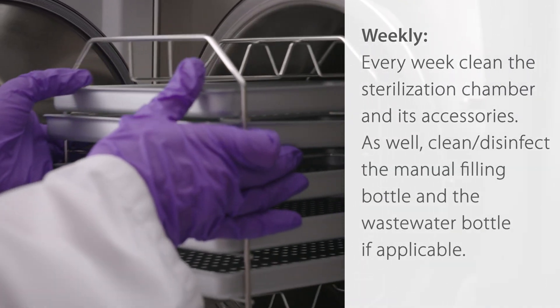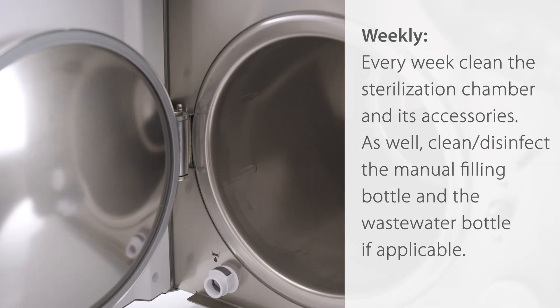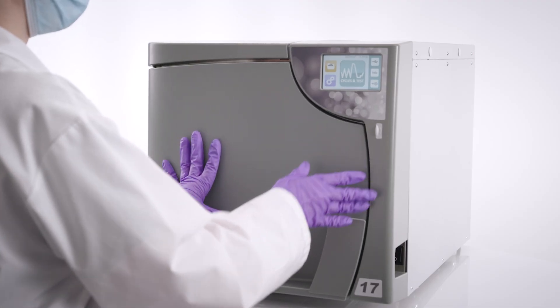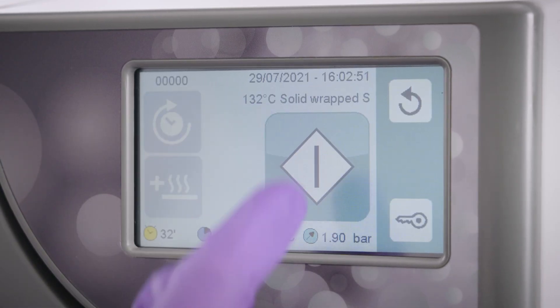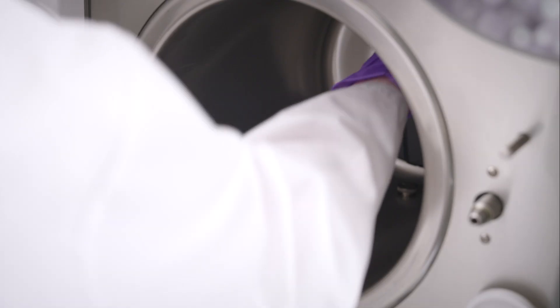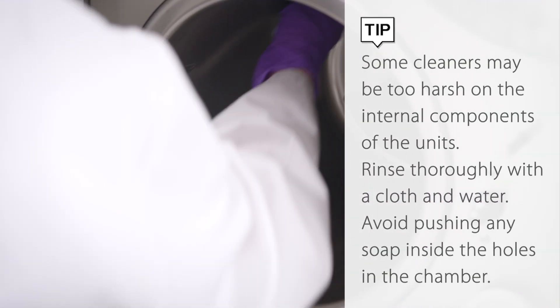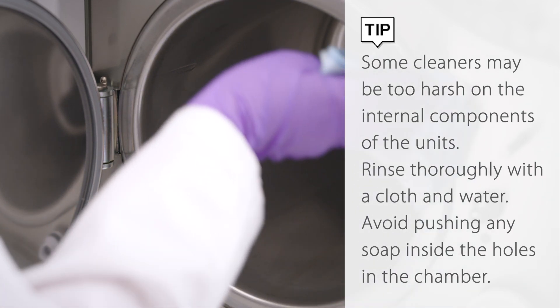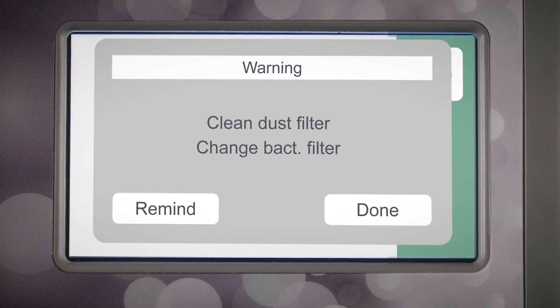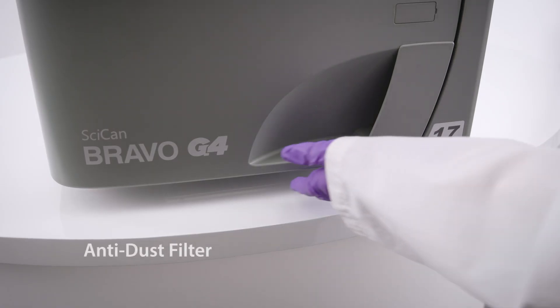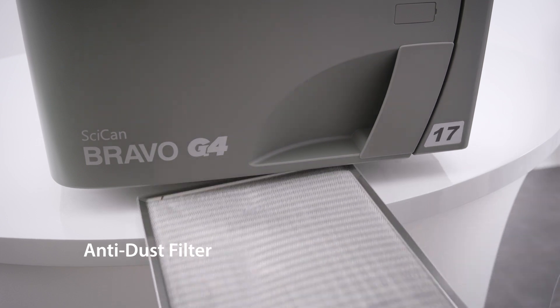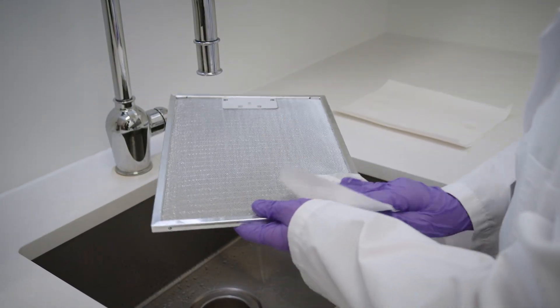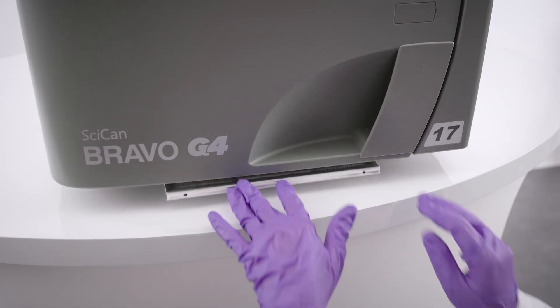Weekly, every week, clean the sterilization chamber and its accessories. As well, clean and disinfect the manual filling bottle and the wastewater bottle, if applicable. Run one empty cycle after using any cleaner or soap. Helpful tip: Some cleaners may be too harsh on the internal components of the units. Rinse thoroughly with a cloth and water. Avoid pushing any soap inside the holes in the chamber. The anti-dust filter should be cleaned weekly as well. To clean the anti-dust filter, remove the filter from the lower part of the autoclave, thoroughly rinse with water, and dry it before refitting. The filter can also be cleaned using a jet of compressed air, making sure not to disperse any dust into the environment.